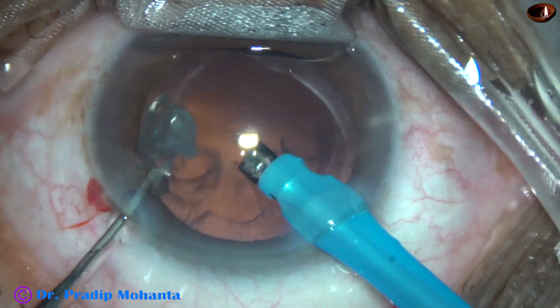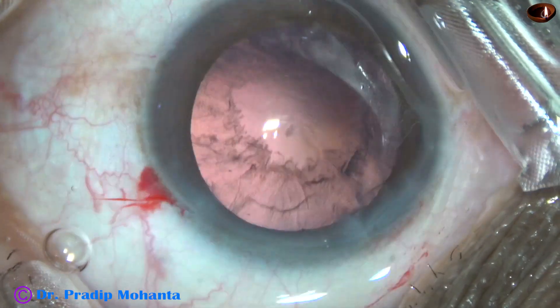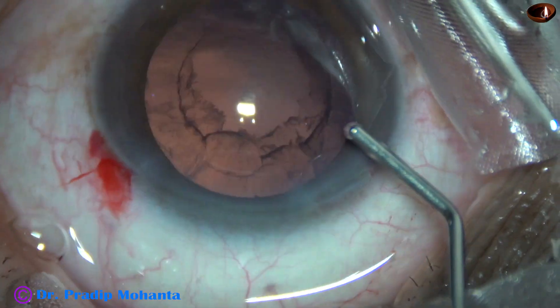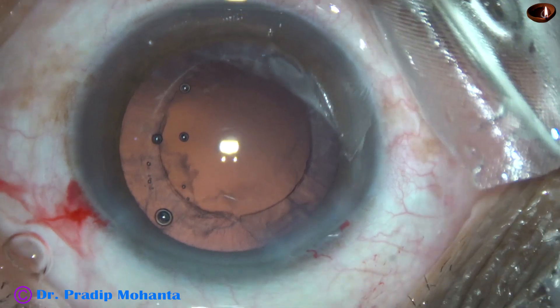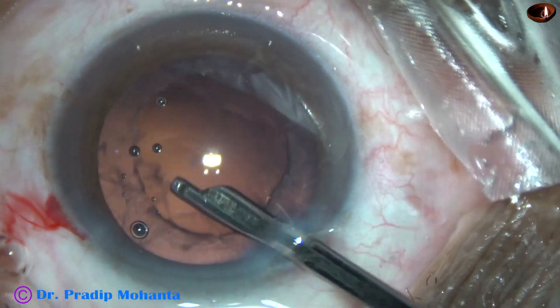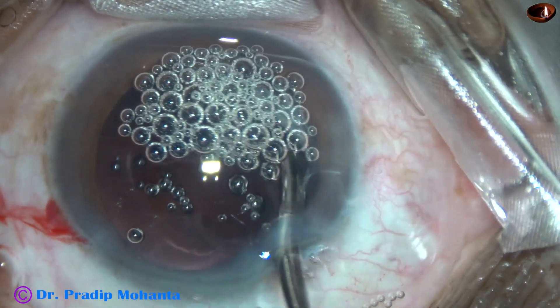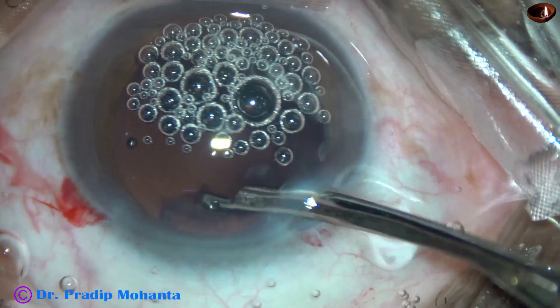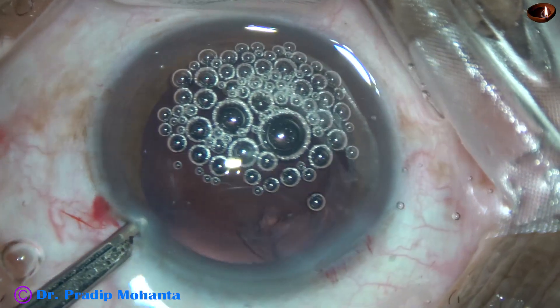The epinucleus is managed and now I come out. Cortical cleanup in this case is being done with the help of a 23-gauge Simcoe cannula. The rexis is round and about 5.25 mm in diameter. The 23-gauge Simcoe is being used to remove the cortex, and a lot of air bubbles somehow collected in the anterior chamber.